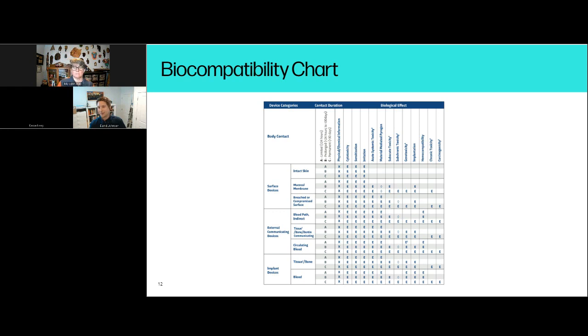Okay. Another question, which I have my input on, but I would love to hear Meredith's perspective. Someone mentioned that they see a lot of custom-made devices that essentially utilize the biocompatibility chart that we showed, saying that HP did all the tests and it passed, so my device is safe. They ask, does this concern you? And that we should include a disclaimer saying that you should do your own testing. I will add, as HP side, there is a disclaimer on the footnote.